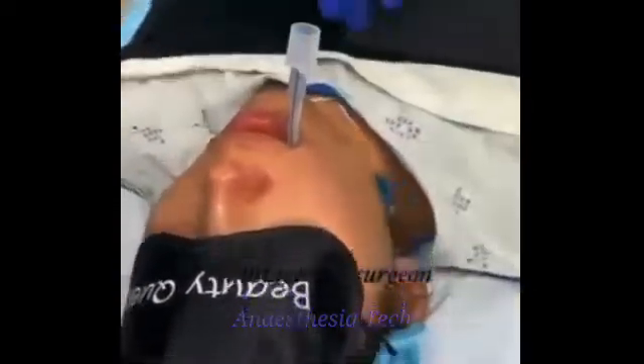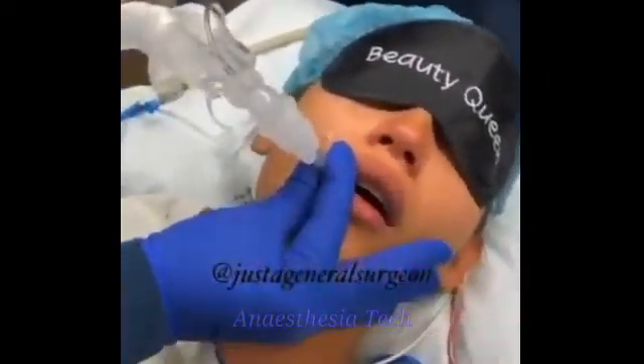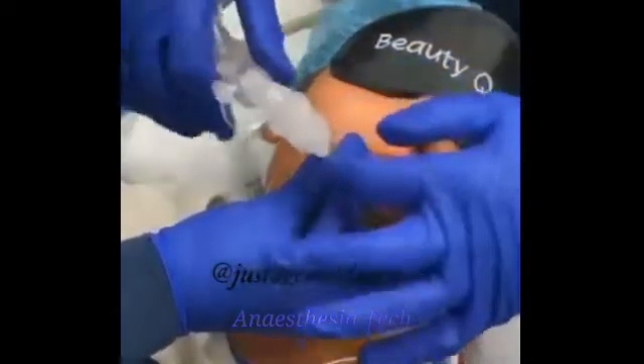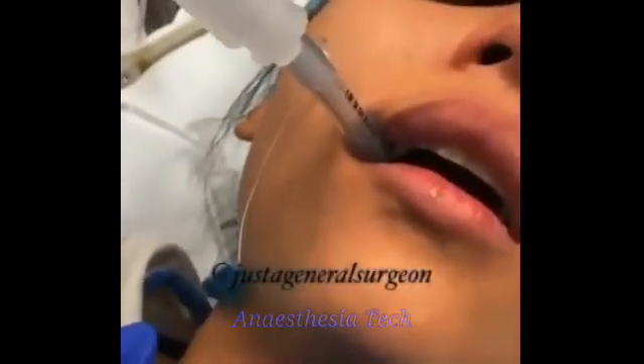Blow up the cuff so that she has a good airway. Turn up to the ventilating machine — by hand again. I know I'm in because I see a mist coming back. Perfect.